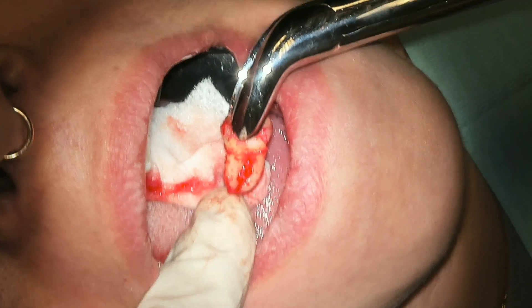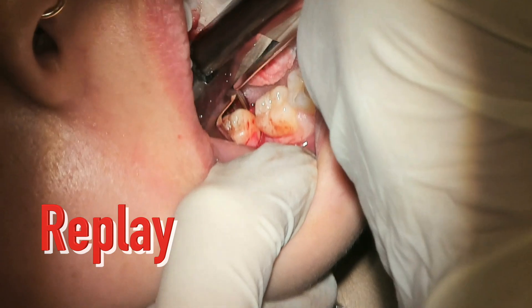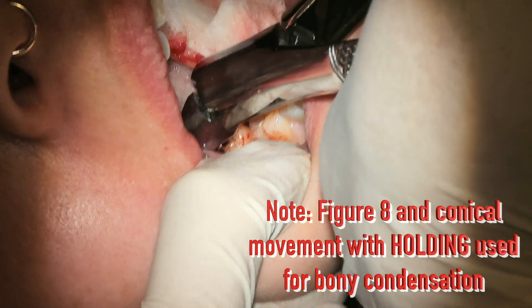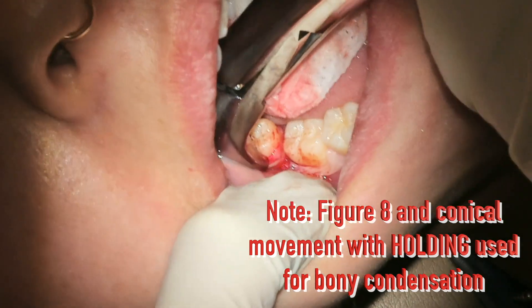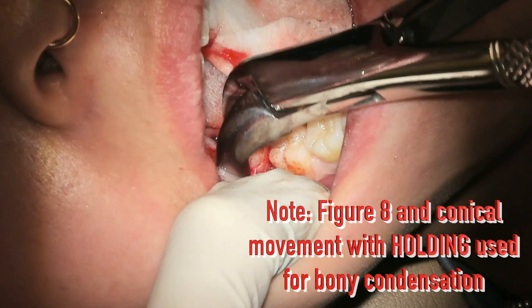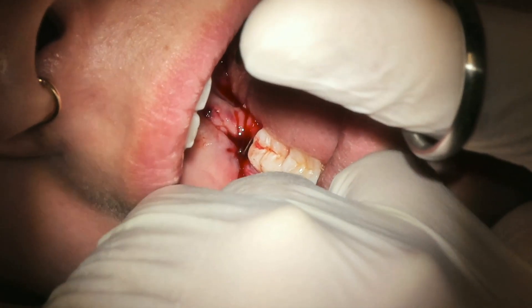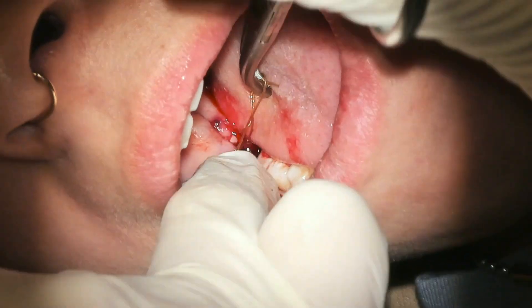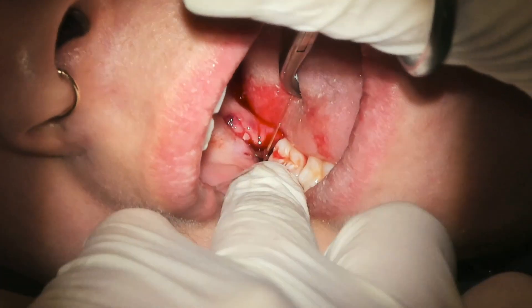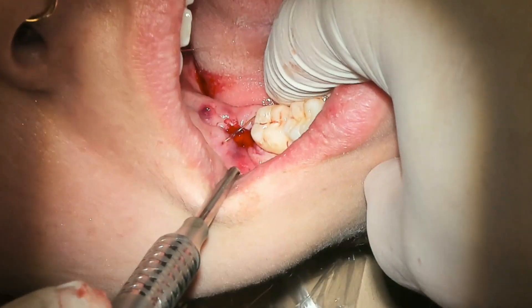So that's another thing to consider. In this technique, for visualization purposes, I went ahead and did it at about an eight to nine o'clock position. The issue with that is the whole head and mandible moves, so you're really not getting as much movement as you think. Instead of my normal figure-eight motion, I had to move the forceps in a conical motion — clockwise and hold it there, then counterclockwise and hold it there. You need to hold it there for much longer than you would think for the bony expansion to occur, but that will actually help separate the interseptal bone out of the mandible.